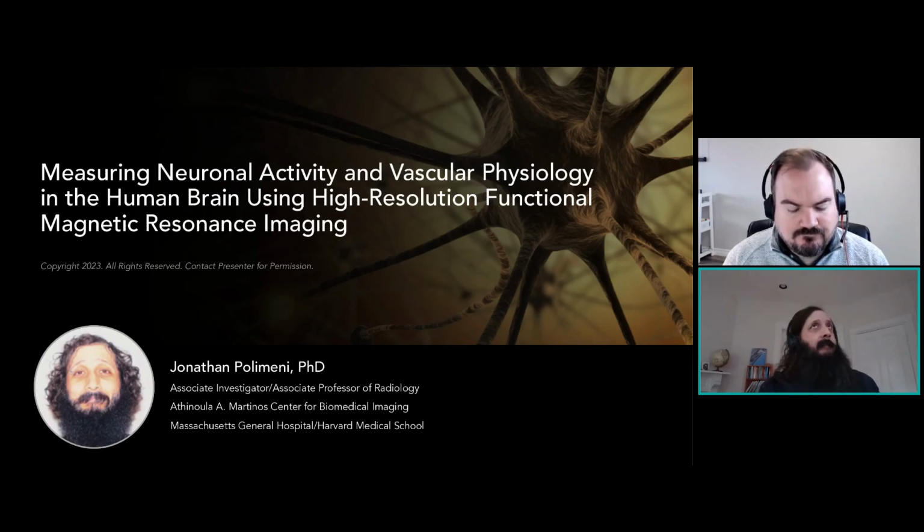And so what I'd say is if the scans are too long, there will be behavioral changes. There can be fatigue, cognitive changes, and so we try to make the scans as short as possible. It really depends. I think that some patients can handle 30 minutes. Some patients are more robust. It's hard to answer that question definitively, but these are some of the questions I would ask when trying to determine this for any given population.